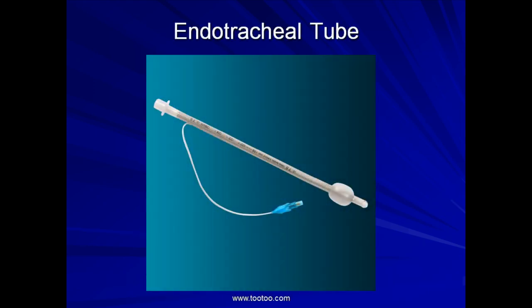Let's take a look at some positive pressure ventilators. First, here is the endotracheal tube, frequently abbreviated ET tube. The balloon on the right side is the cuff, which creates the airtight seal within the trachea. The cuff can be inflated or deflated through the blue port.